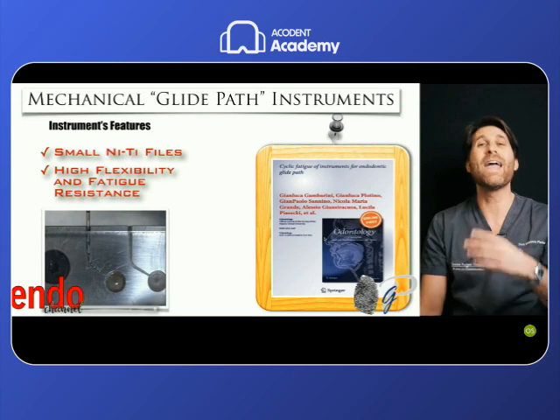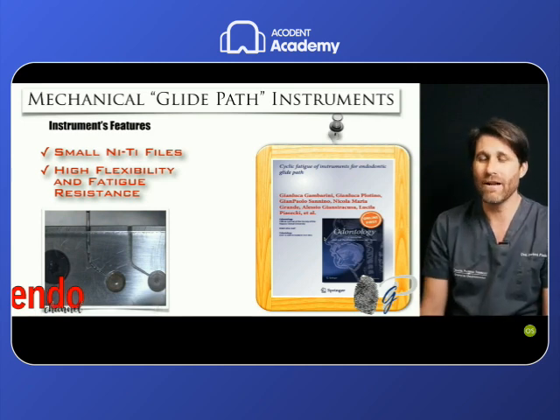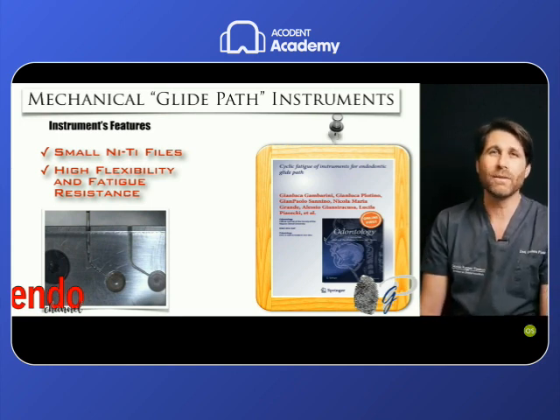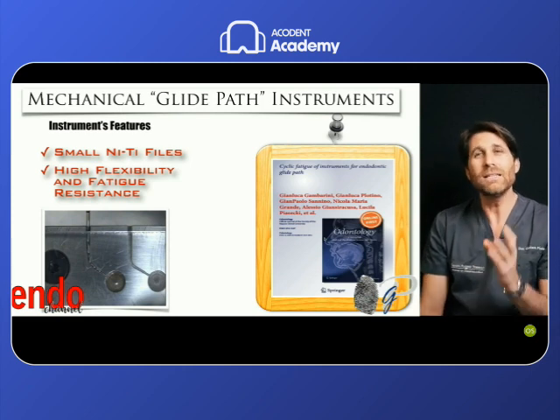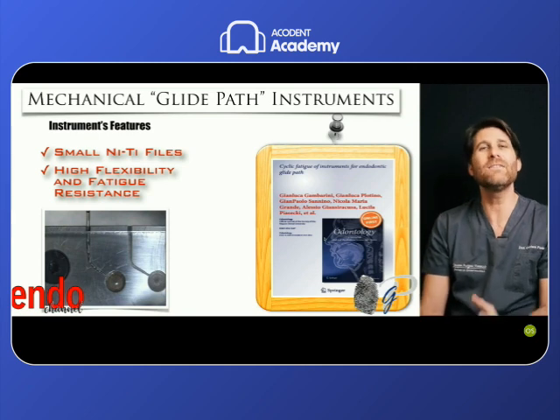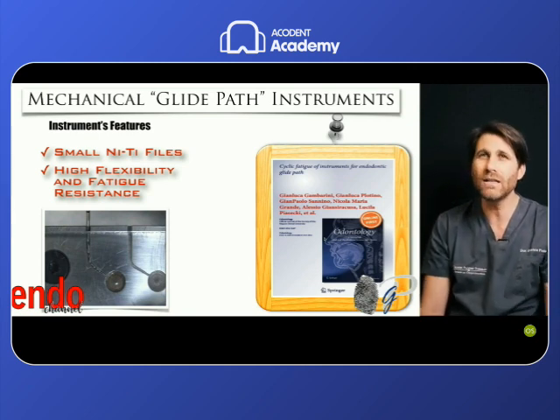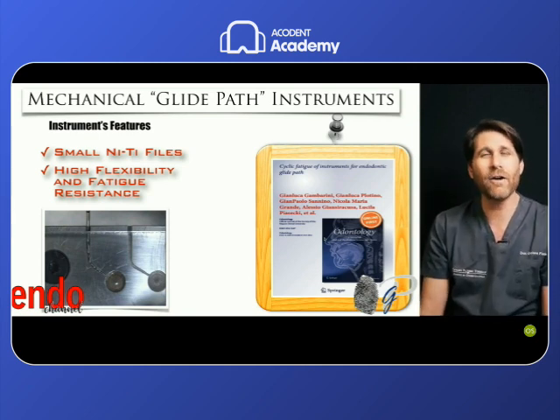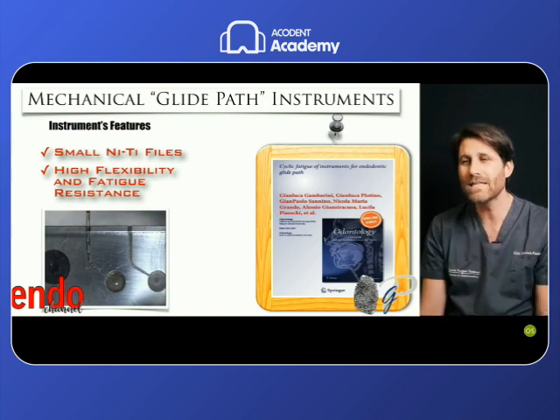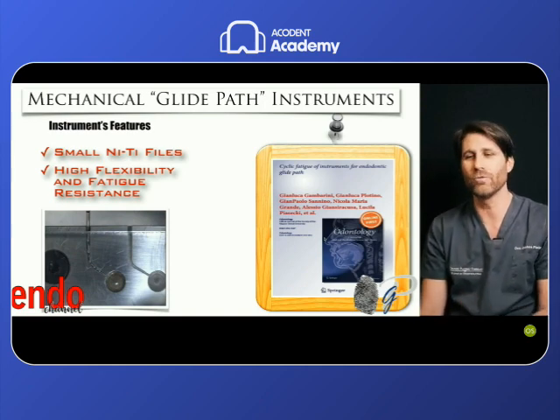We already have enough flexibility and fatigue resistance with the standard nickel titanium, or M-wire nickel titanium, that is a thermally treated nickel titanium with properties of an austenitic file. So this is not a limit for this file. This is a good point for these files, even in standard nickel titanium. We don't need a very strong, advanced heat treatment to increase the flexibility of these files, because they are already flexible enough to penetrate any kind of curvature.